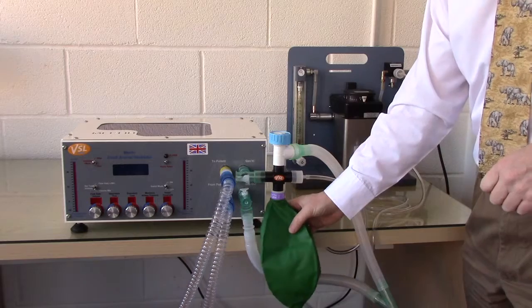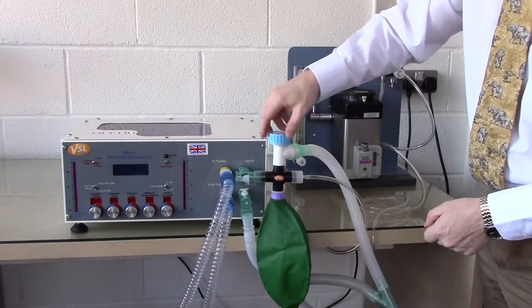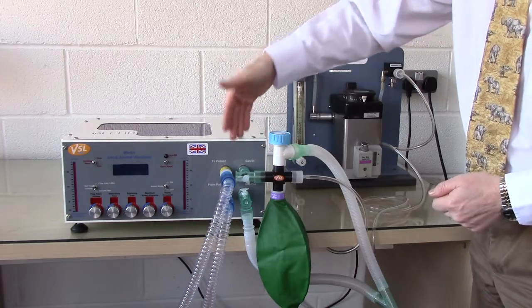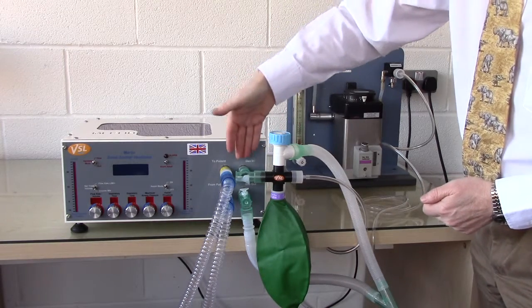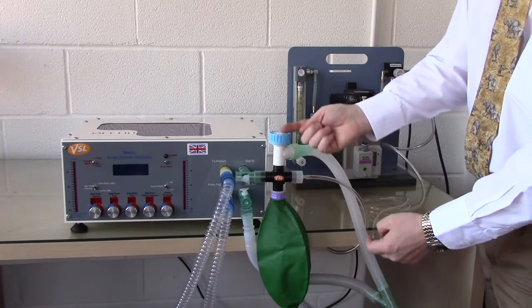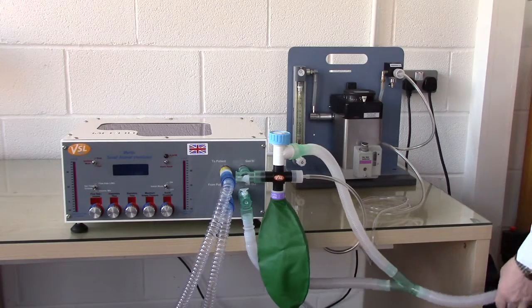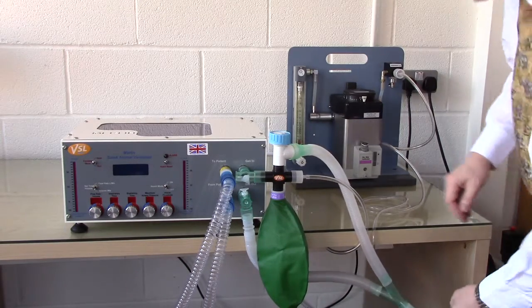Below the valve connector is a 2-litre bag, acting as a reservoir bag for incoming gas. Above the connector is a spill valve, or APL valve, for evacuation of excess gas. When excess gas fills the bag, it will over-spill and pass out through the spill valve into the waste circuit.